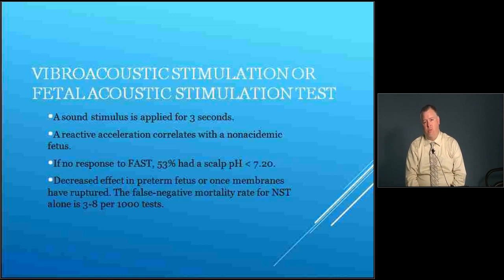And then once membranes are ruptured, the acoustic stimulator does not work quite as well either, because sound waves travel better through water, and if the membranes are ruptured, there's decreased water there, so the sound waves do not travel as well.